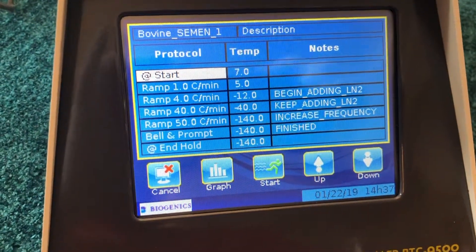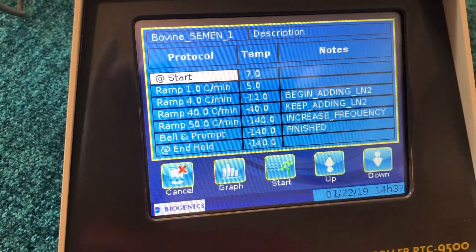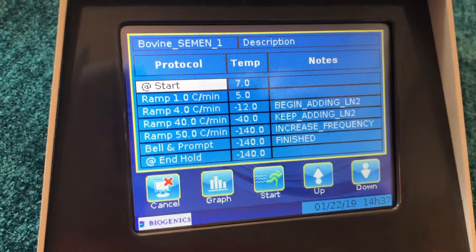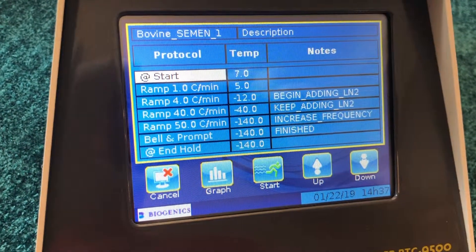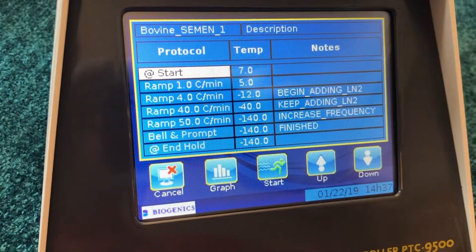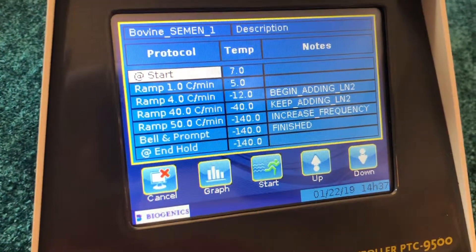It's going to start at 7 degrees, ramp at 1 degree per minute to positive 5 degrees, then ramp at 4 degrees per minute to minus 12 centigrade. Then it picks up speed as we begin to add liquid nitrogen: 40 degrees per minute down to minus 40, and 50 degrees per minute down to minus 140, and then the bell will sound at the end of the program.